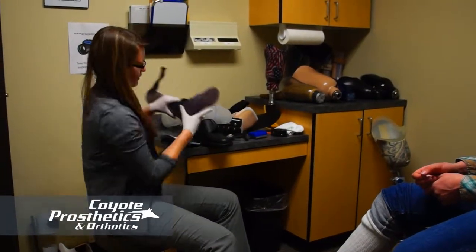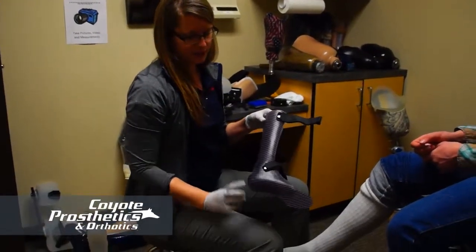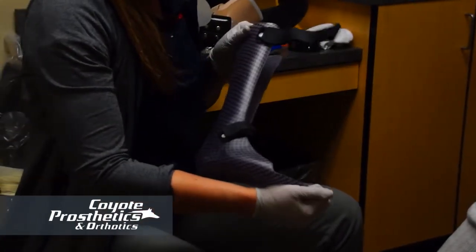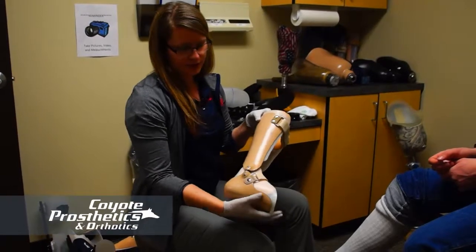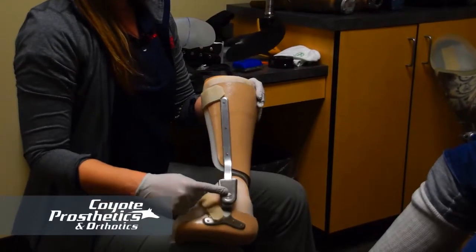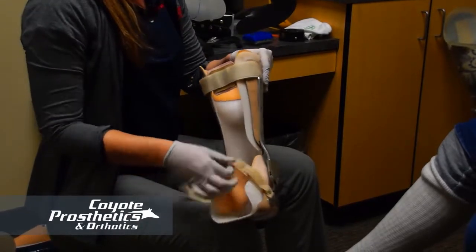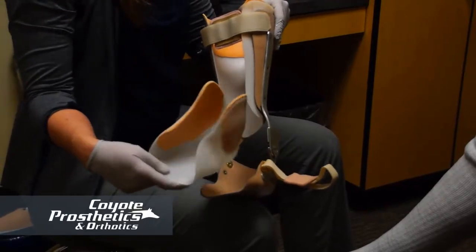Just to show a couple of different kinds of AFOs — this is a solid ankle AFO, so it doesn't have any hinges, and it has two straps with some padding at the ankle. This one is a hinged or articulated AFO with an adjustable joint on the side, so we can adjust the amount of motion. It also has a flexible inner boot to give a little more control of the foot.